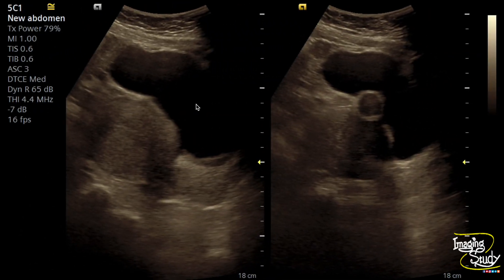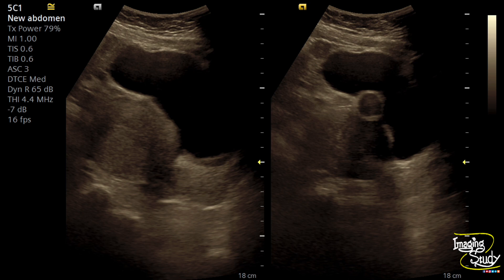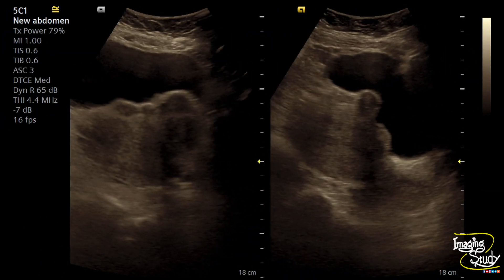Here's the transabdominal ultrasound picture. The uterus looks bulky — we'll measure it later — and this is the subserous fibroid. This hyperechogenic line is the pseudo capsule. If you've seen my previous fibroid uterus case videos, you know that this pseudo capsule is a very important point if you want to detect a fibroid. These are transverse and longitudinal sections, and you can see these fibroids at the anteromyometrium.